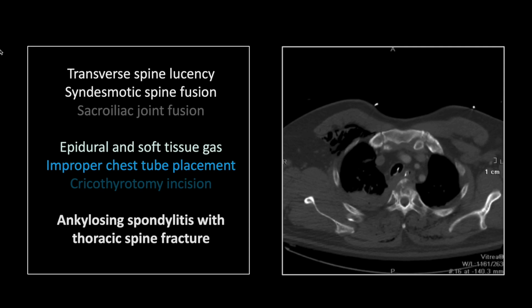All right, moving on to our next complications. I don't have companion x-rays for these, but these next two cases are both the dreaded complication of ankylosing spondylitis, and that is a transverse or banana fracture of the upper thoracic or lower cervical spine from intubation in ankylosing spondylitis patients. Of course, ankylosing spondylitis causes such a stiff and inflexible spine that when the patient is put into the sniff position for intubation, it can snap the spine. And that is what we have here.